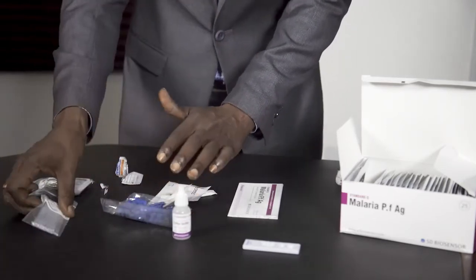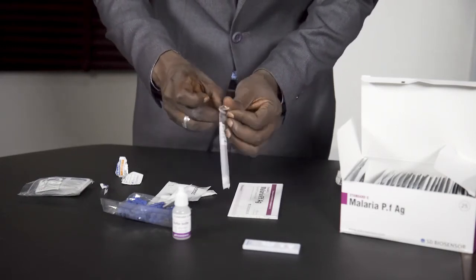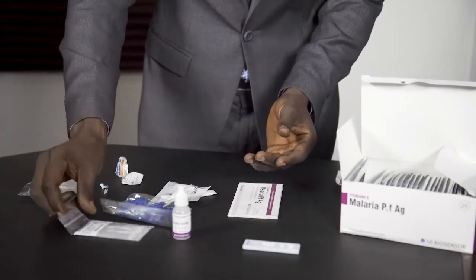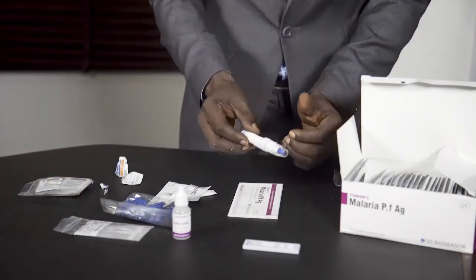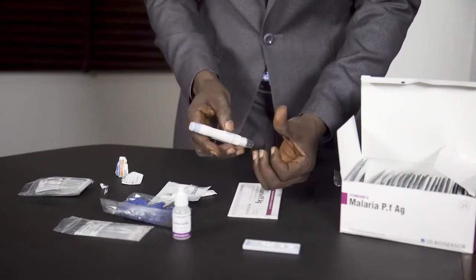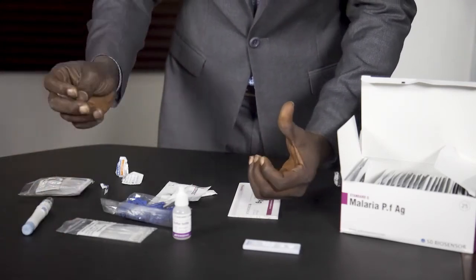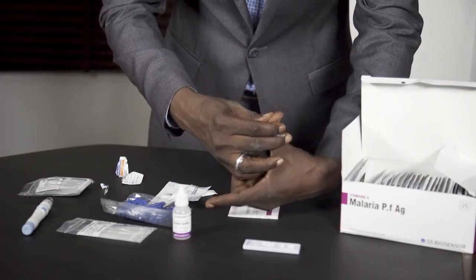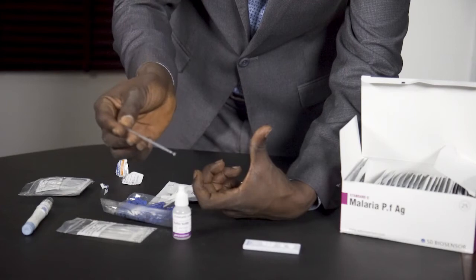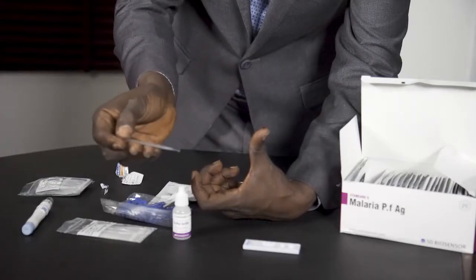When that is done, you prick the finger that you have cleaned and take the blood sample from that finger. I'm going to use the lancet device to prick the hand for blood. To take the blood sample, you just use the collection rod to touch the blood and it will take the required amount of blood.